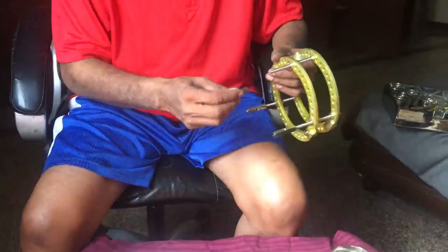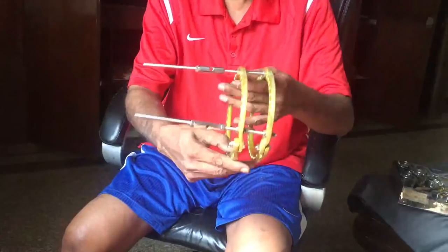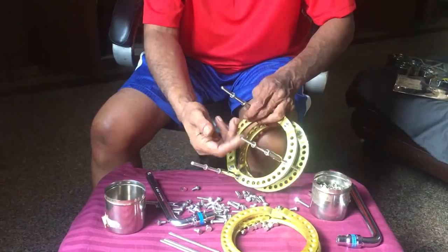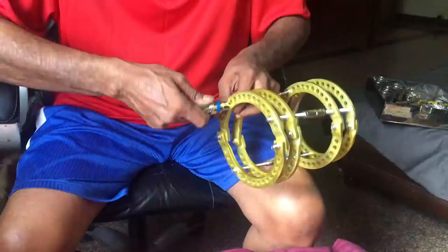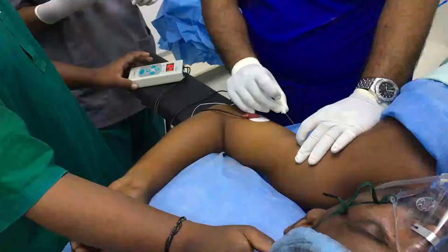The proximal block and the distal block are now connected with threaded sockets. I have compared my forearm with the patient's forearm and found that as they were more or less of the same size and girth, I have decided to use my forearm as a template for making this prefabricated frame. In very slim or extremely obese patients, we can use the opposite normal limb to make the prefabricated frame. Once the frame is ready, it is autoclaved with the other instruments for surgery.